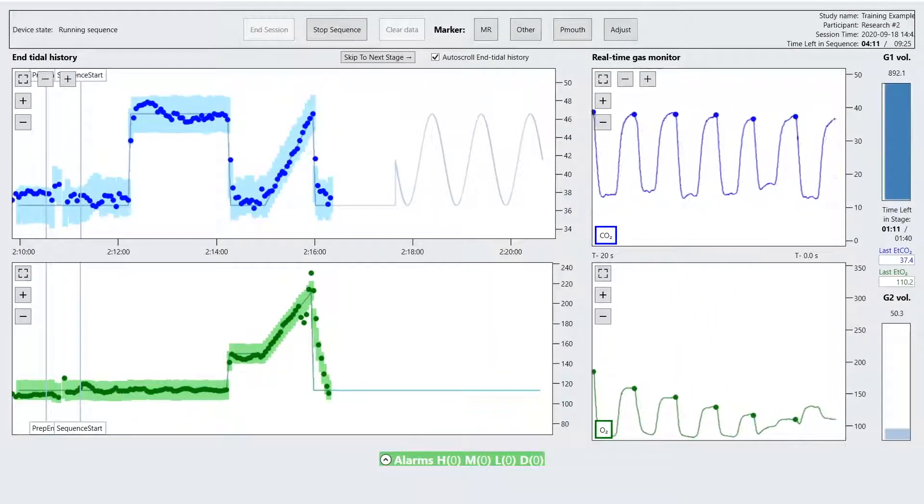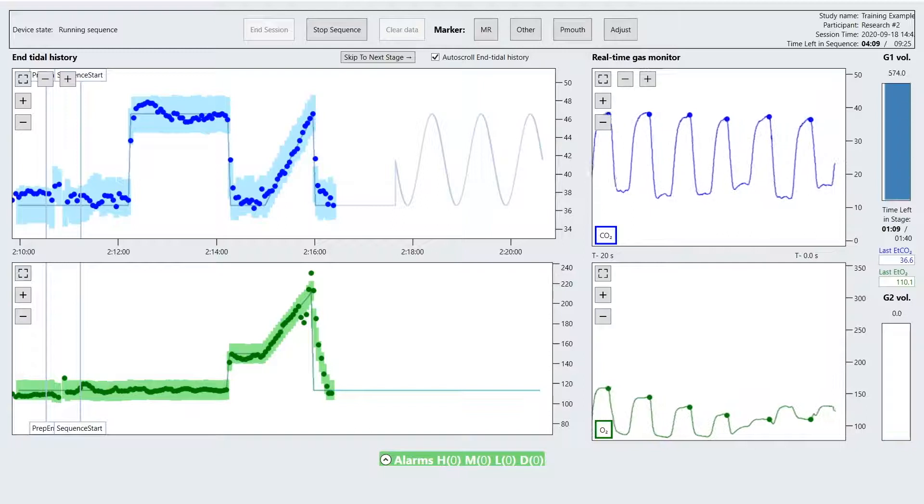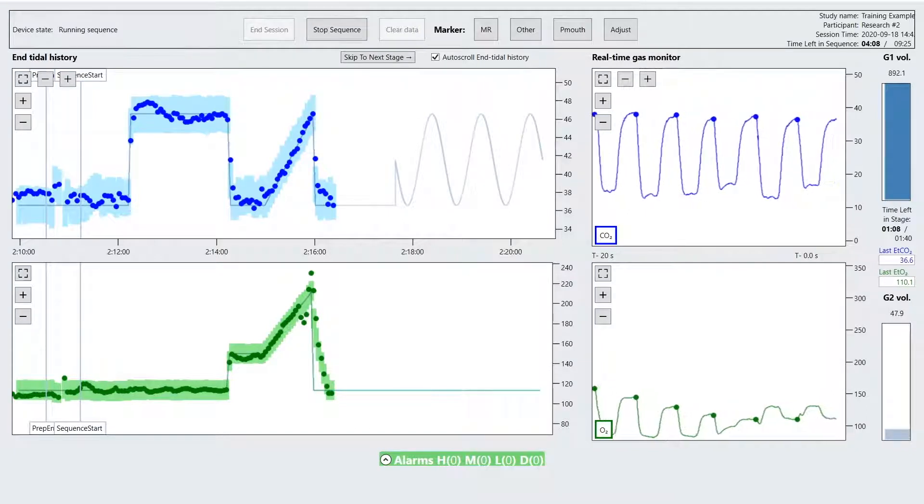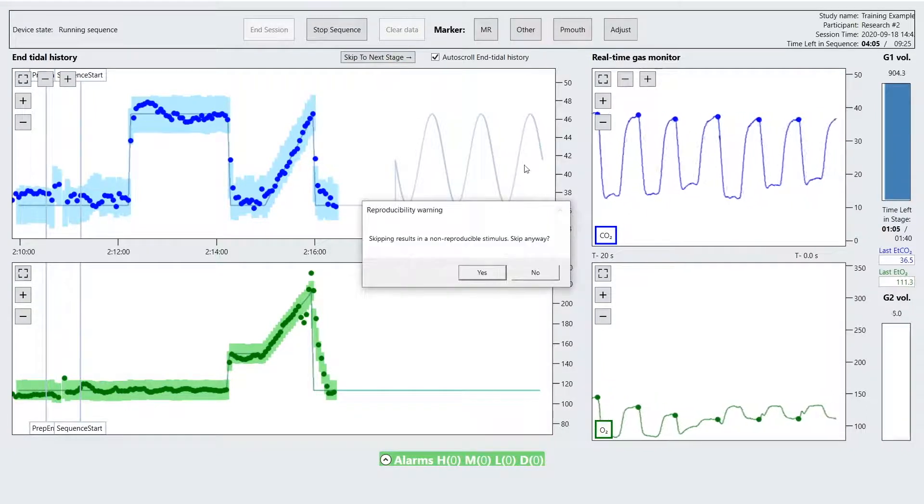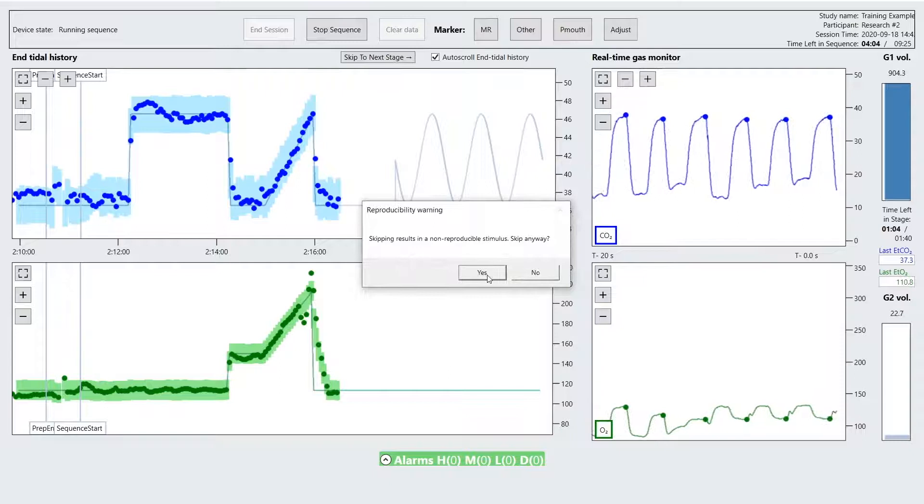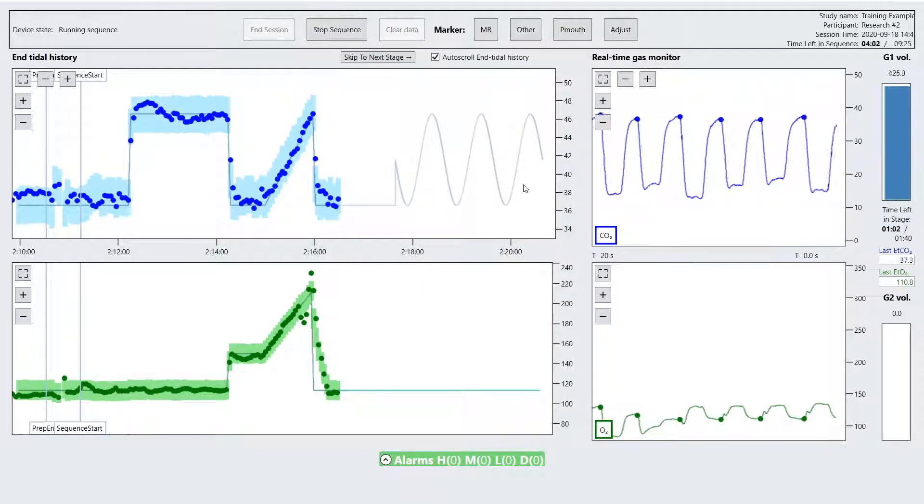When running a study, the operator can choose to skip to the next stage by pressing the skip button. The time at which the skip occurred is logged in the event text file.